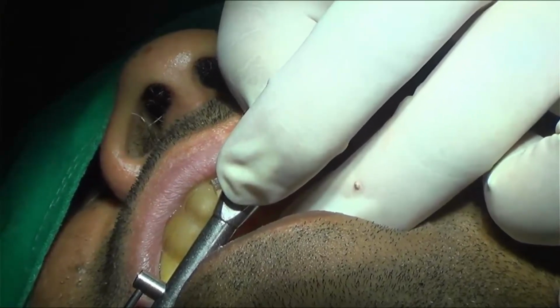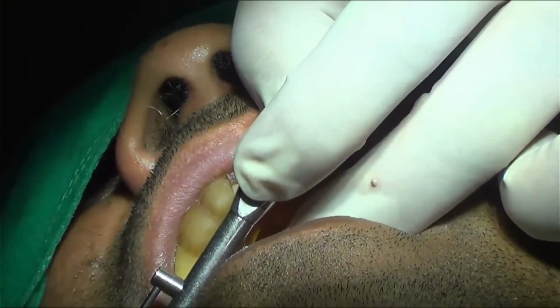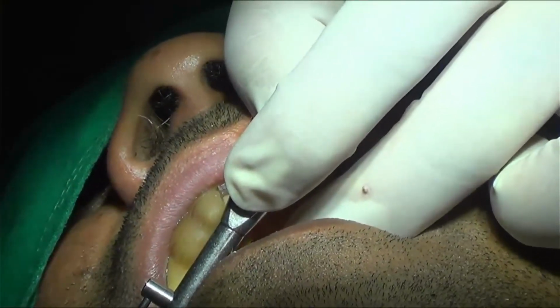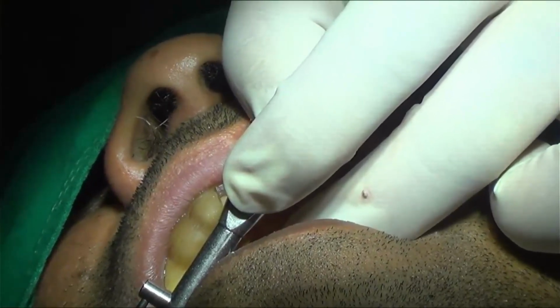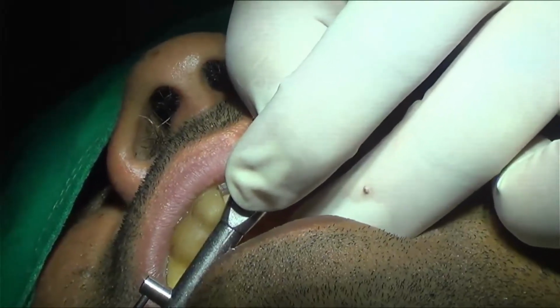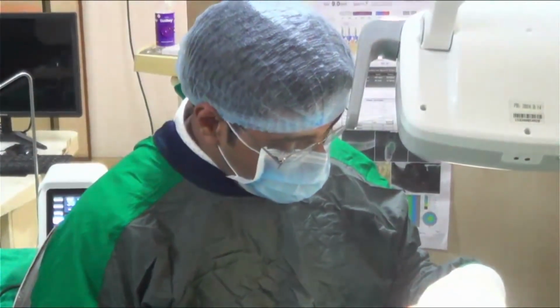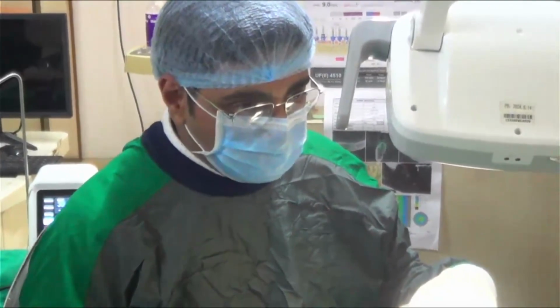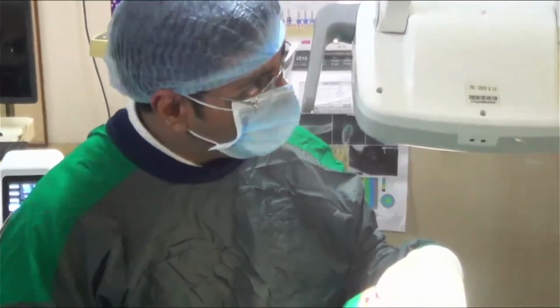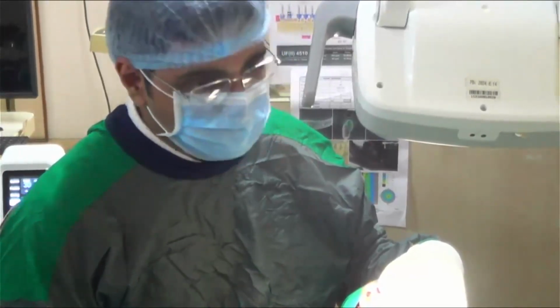So we should always wait for minimum 1 minute after the detorquing is done, and the ratio is always 1 detorquing and 2 torquing. So we have detorqued 3 times, we can torque till 6 times. That is what ideally we need to do. If we are reaching a higher torque before 6, then again we need to detorque. Okay. So this is approximately your 1 minute over. We will wait.